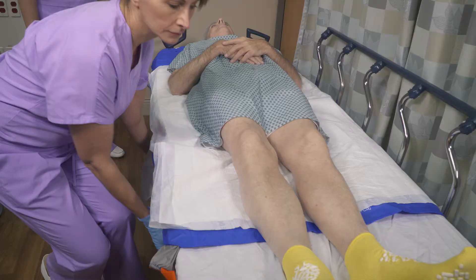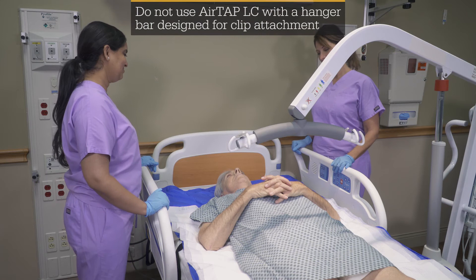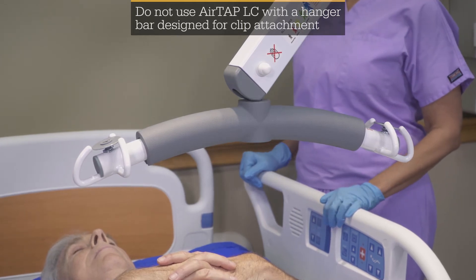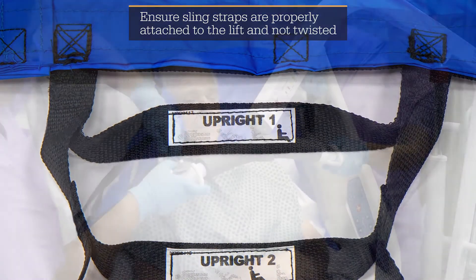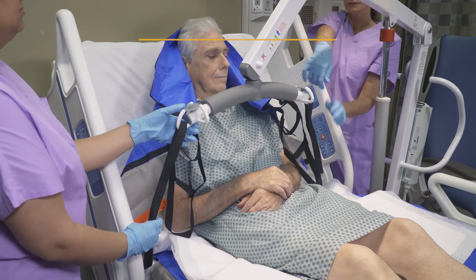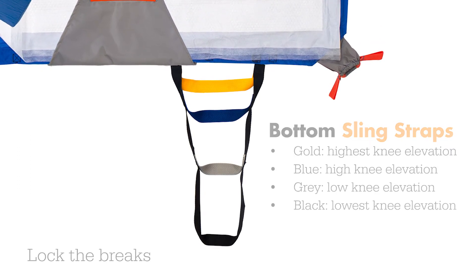Raise the rails. Before performing an upright one, upright two, or reclined lift transfer, ensure the bar attached to the lift is set up according to the manufacturer specifications and your facility's protocol. Place the bed at the health care provider's waist level and raise the head of the bed to an upright position. Attach the upright one top sling straps to the lift, then attach the middle sling straps. When attaching the bottom sling straps, choose one of the following pairs. Always make sure the patient's knees are elevated above the hips prior to lifting.